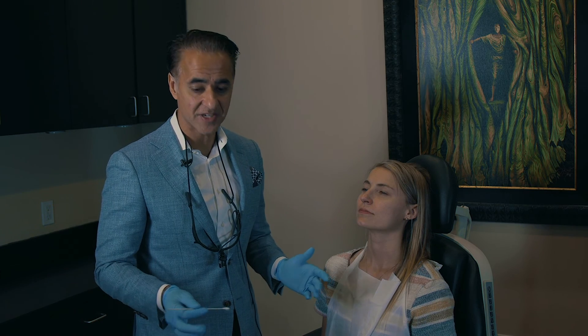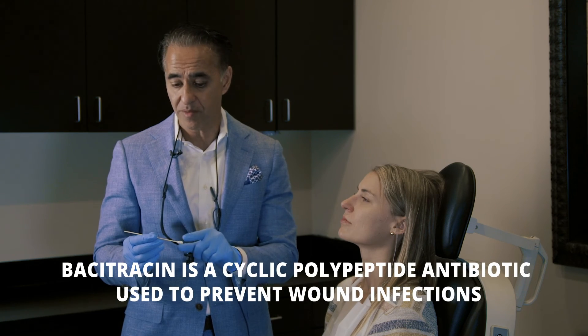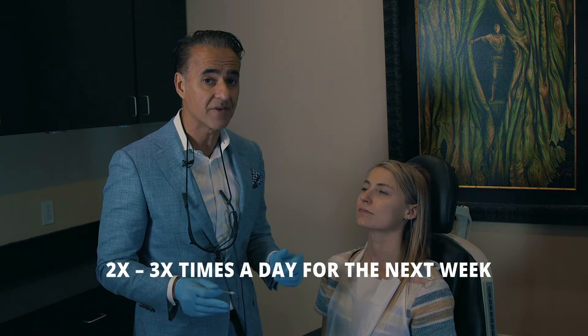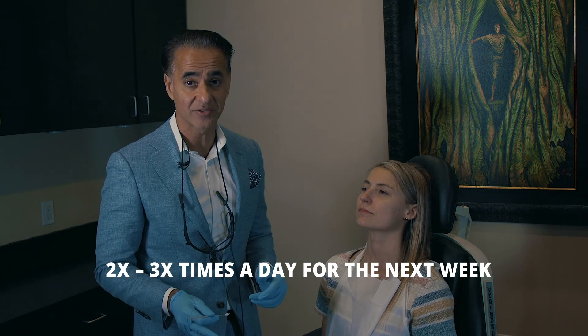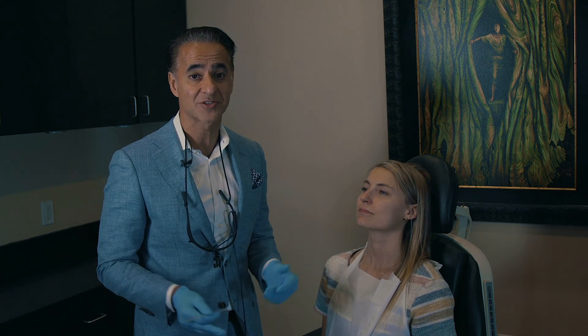Once all the cauterization is done, the last thing we do is apply a little bit of bacitracin antibiotic ointment right on the inside of the nose exactly where the cauterization was done. Then we'll have her do that two or three times a day for the next week as that area heals. That's it — that's office cauterization for recurrent epistaxis, or nosebleeds.